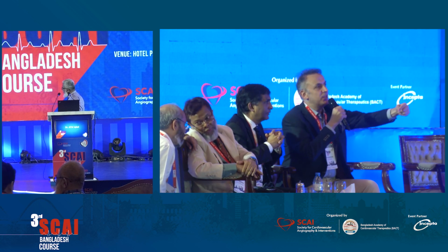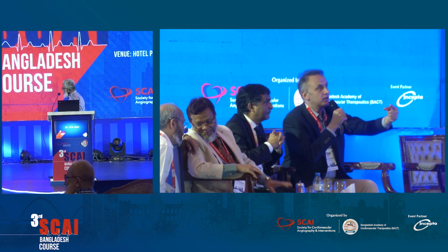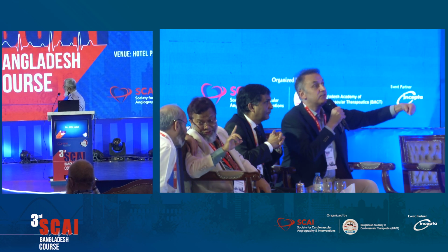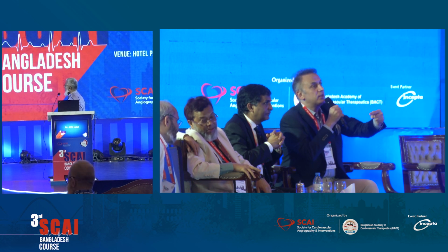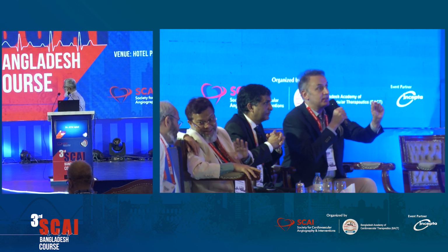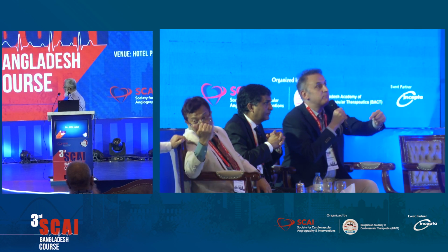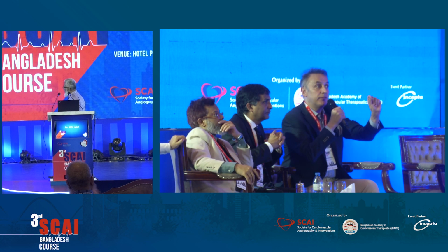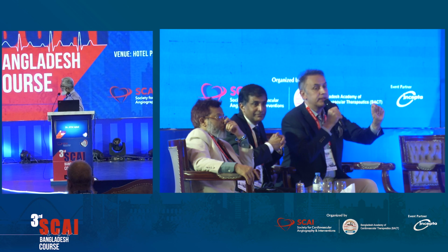After predilatation of the stent strut, you had better do kissing, first kissing. Because you don't know if you are through the true strut or under the strut. Nobody knows it. So I think for the best result, we should do first kiss, then stenting of the main artery and second kiss. This would be the important point. If two kisses, the result is very good.